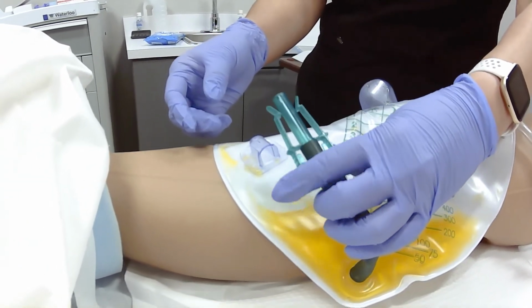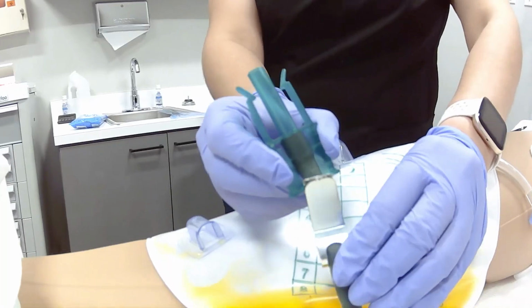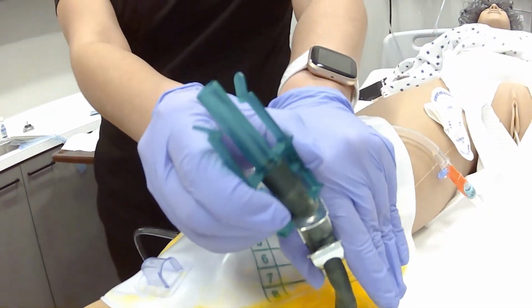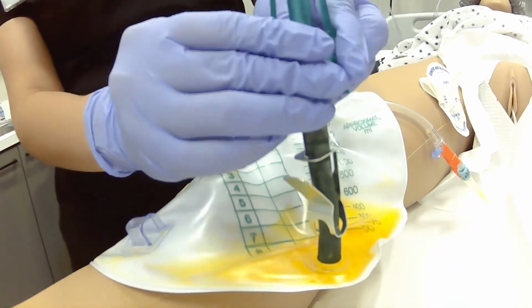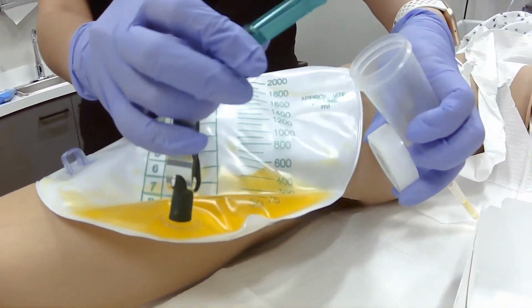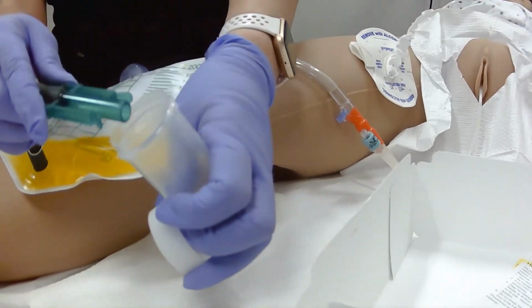You're going to push down on these two clips to release it from this little holding chamber, and then there is a metal clip, or clamp, that you push up on, and it releases that clip, and there we go, and it will allow you to have your urine. So I would get my little cup, and this would be done at the side of the bed with this hanging, because again, you don't want that urine to reflux back.